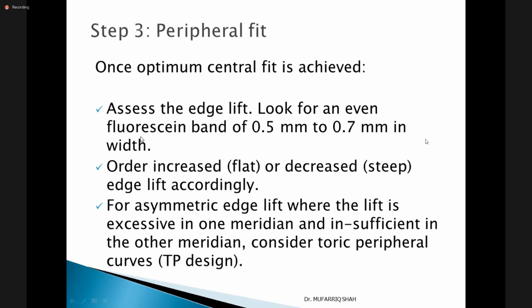Look for an even fluorescein band of 0.5 millimeter to 0.7 millimeter in width. So after central fit, you should concentrate on the edge lift, and the fluorescein band should be between 0.5 to 0.7 millimeter in width. Order increased, that is flat, or decreased, steep, edge lift accordingly.